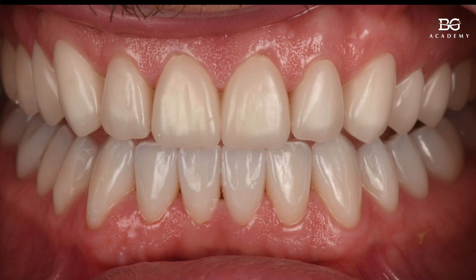The upper teeth have milled PMMA provisional restorations. We usually use this combination to test drive the occlusion, and then if we need to make any kind of equilibration, we can do adjustments on the upper arch on these provisional restorations, and then transfer the data to our dental technician by a scanning process.